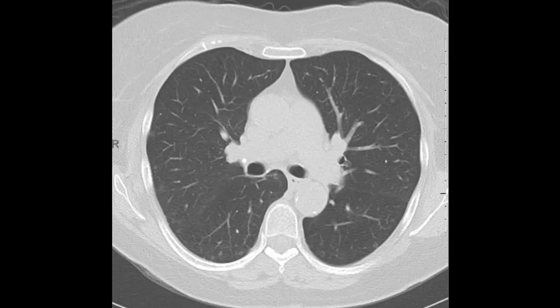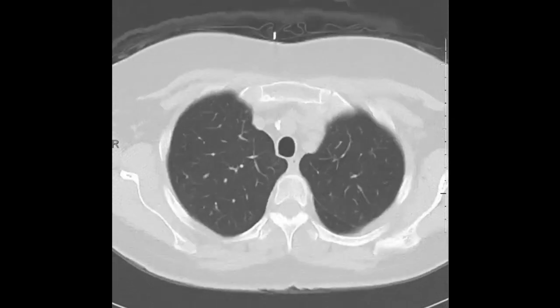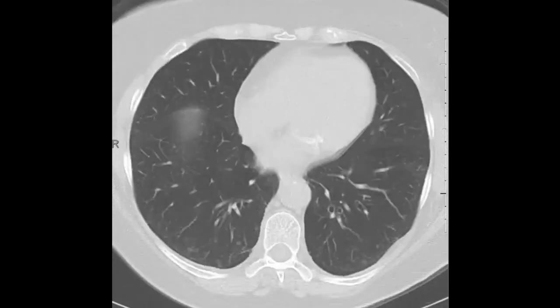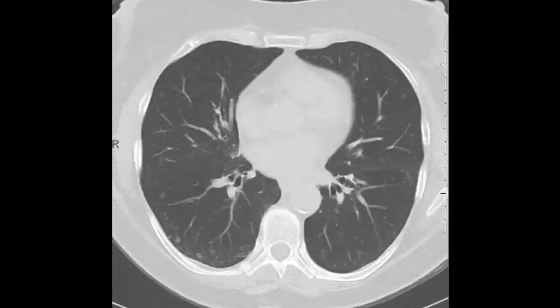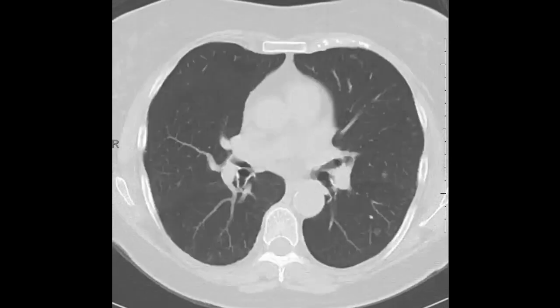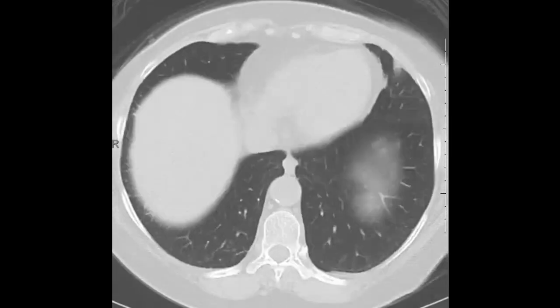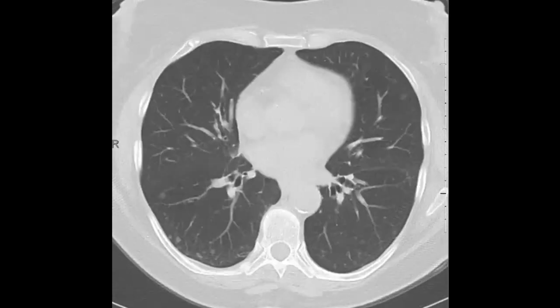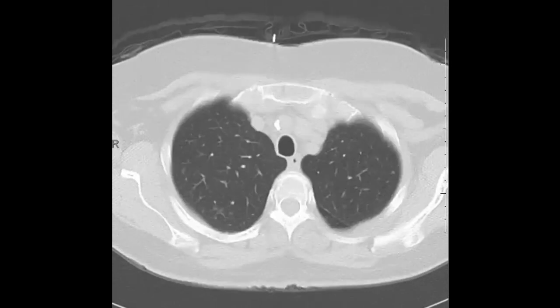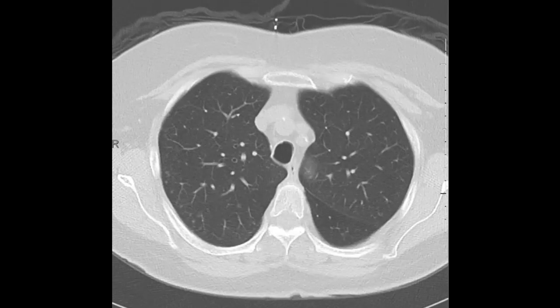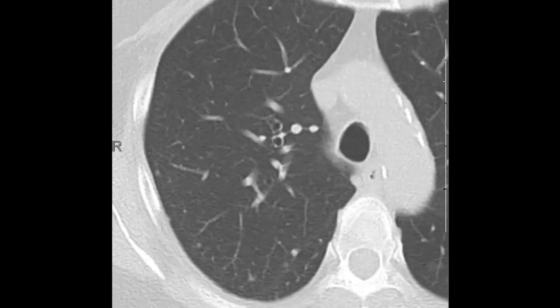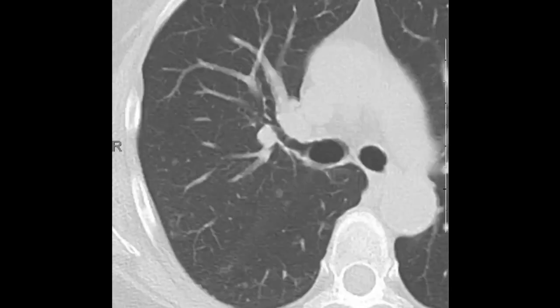Here we have a case of diffuse nodular lung disease — innumerable nodules throughout the lungs. Scrolling through, there is a posterior predominance, but otherwise in the axial plane it looks pretty random, with some areas peripherally predominant. In the zonal plane — superior to inferior — there is probably a basal predominance, or maybe diffuse distribution, but certainly not upper lung preponderant. We see all these nodules; many are ground glass or sub-solid attenuation.